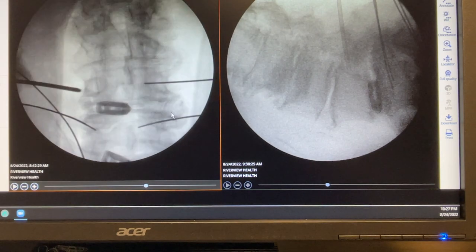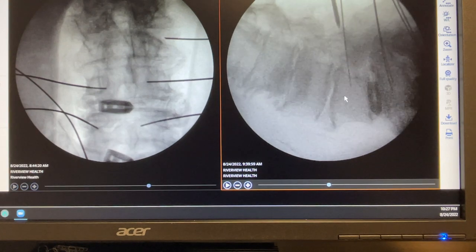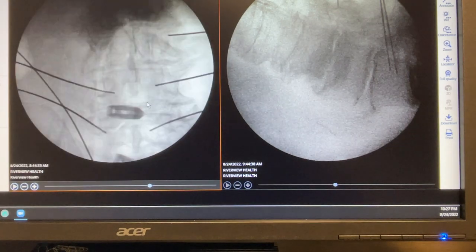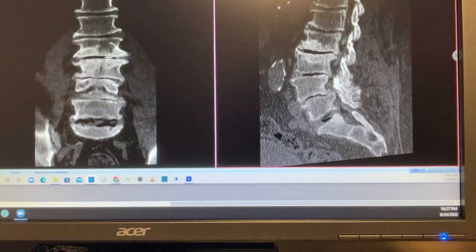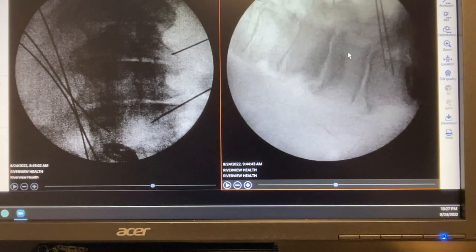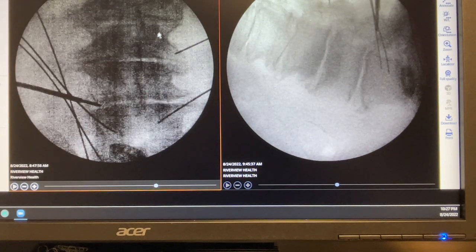After instrumenting that level, we move to the next level — L3-4 — in the same fashion. On the AP view, image quality is very poor because the bone is severely sclerotic. There is a mass visualized here during surgery that obstructs our view, but we are still able to identify the pedicle, disc, and spinous process landmarks, and that is sufficient.